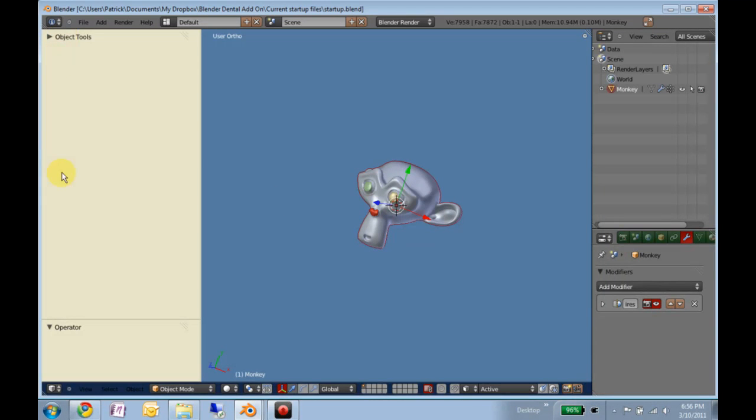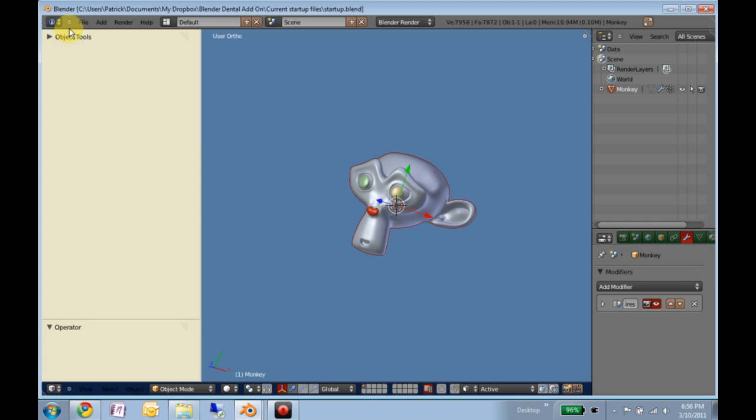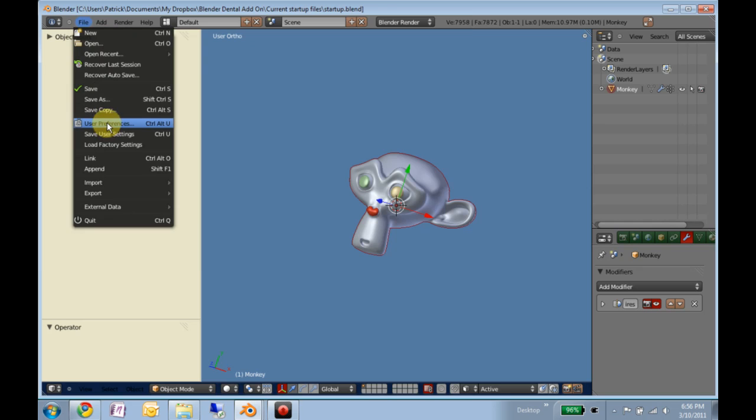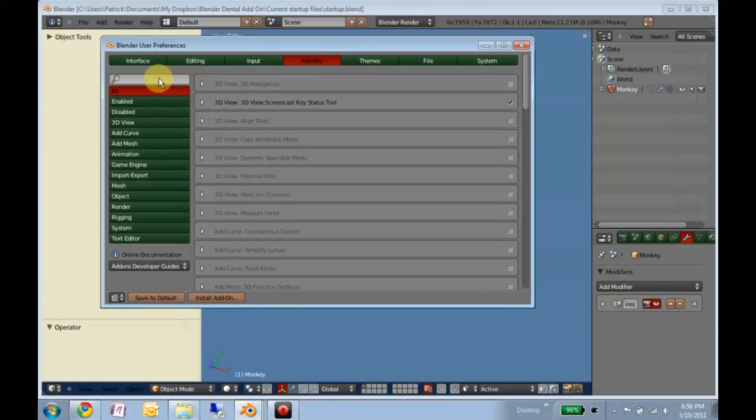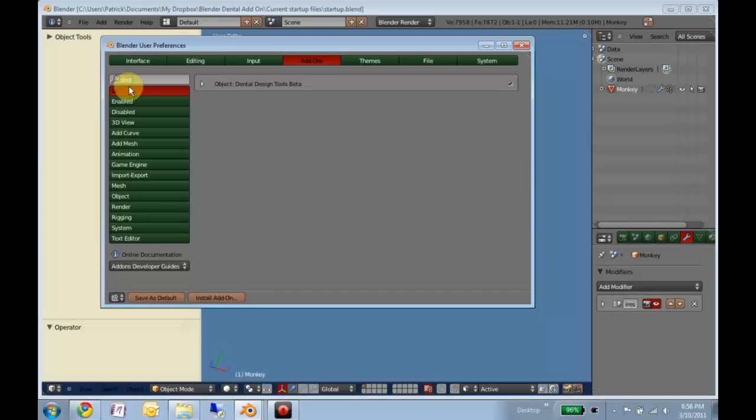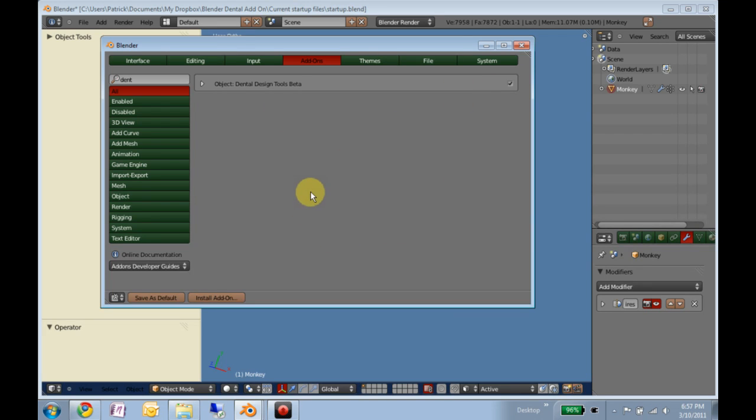It'll give you this quad view here and your regular view here. You'll notice there aren't any add-ons here. When you first open this up, it doesn't automatically install the add-ons for you. Go to file, user preferences, uncheck this, and then check it again. And now every time you restart, this will be enabled.